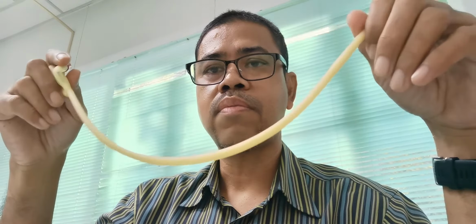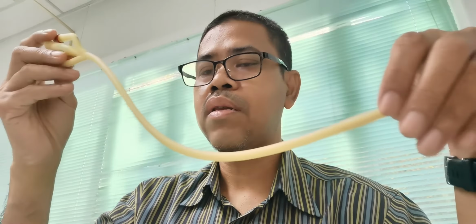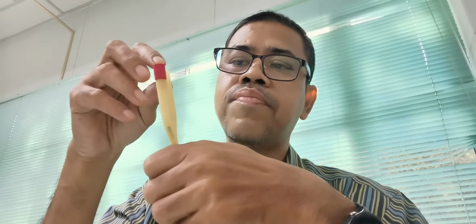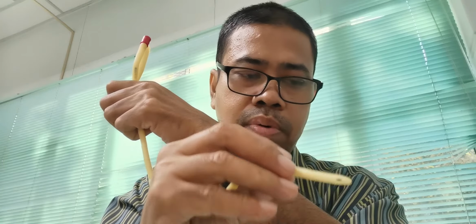So when you encounter the problem, how are you going to solve it? One way, the safest way, is to push the catheter back all the way to the end and then use water for injection or saline. Try to inflate the balloon as much as possible with the intention of rupturing the balloon, but the main precaution here is the tip of the catheter must be inside the bladder. So you push until the balloon ruptures.